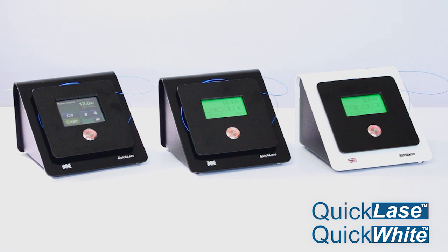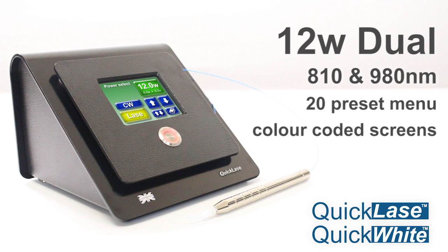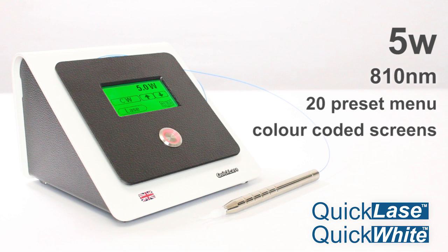We have a range of lasers starting with the flagship, the 12W Dual with an 810 and 980 nanometre wavelength, 20 preset menu and colour-coded screens. The 10W Dual again with dual wavelength technology, 20 preset menu and colour-coded screens. The most popular of our lasers is the 5W with an 810 nanometre wavelength.